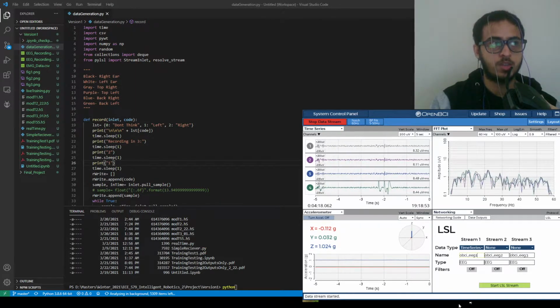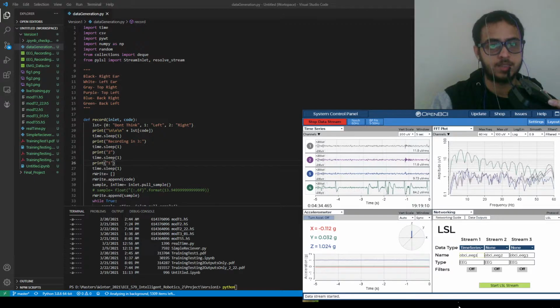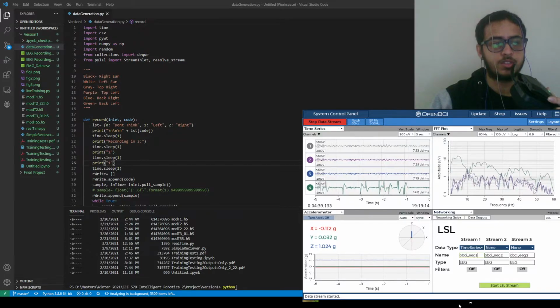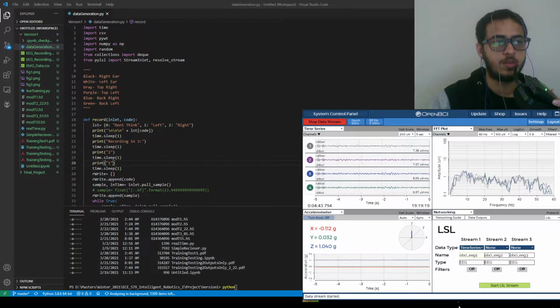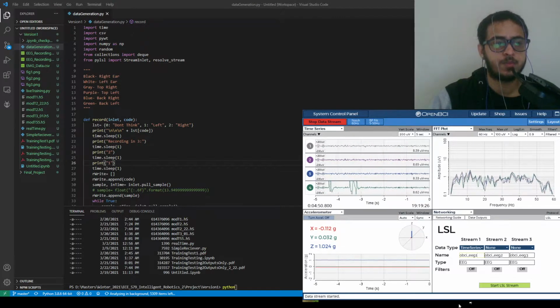My Python code randomly generates one label. It will be either don't think, left, or right, and it gives me 3 seconds before recording, and during that I need to prepare myself to think accordingly. After the countdown is done, it will record my brainwaves for around 2 seconds and save it. So let's go into recording.